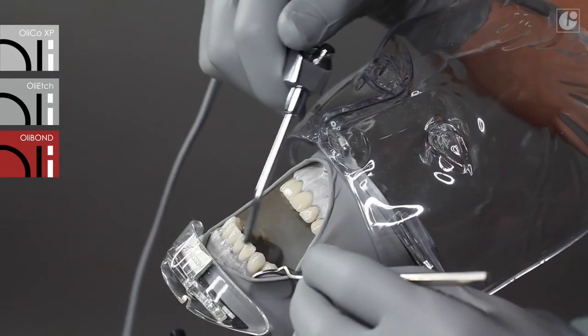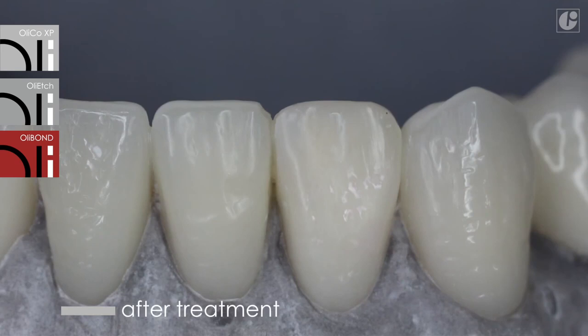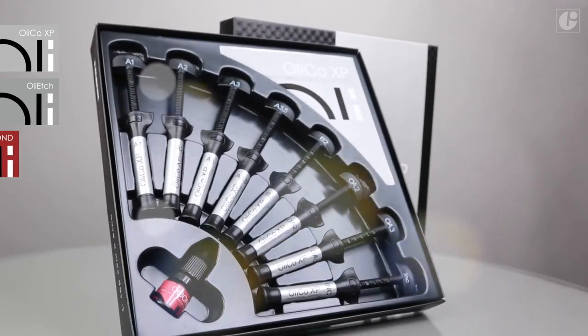At first, the reconstruction with OliCo XP impresses with its aesthetics, and in the longer term, with its long-lasting gloss and resistance to abrasion. It is a proven expert in nanoceramic technology.